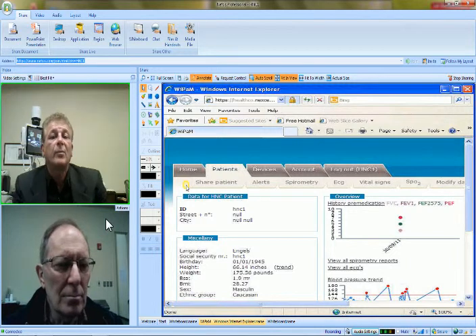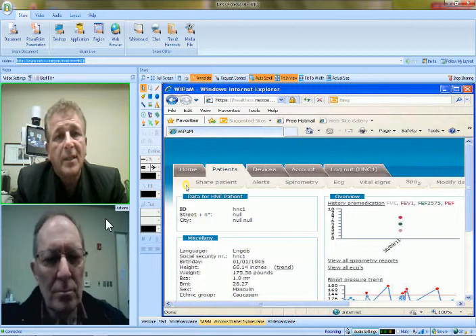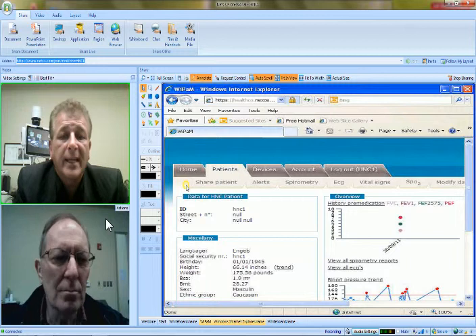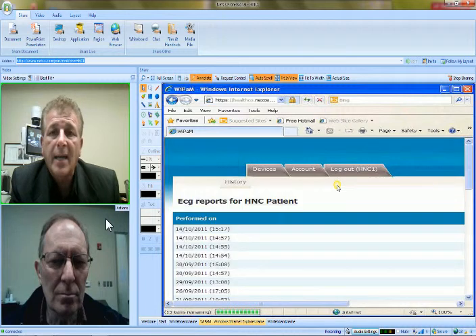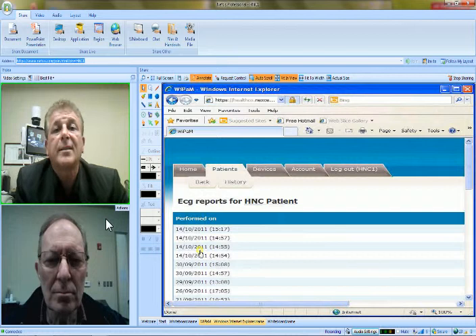So in this case, I'm looking at Bob's numbers, and I'm asking him, and we're interacting, and we have all of his specialists involved, and I can address issues before they get out of hand. I may want to look at Bob's ECG reading. Perhaps Bob just discharged from the hospital last week. He had a cardiac event. I sent him home and he is nervous.